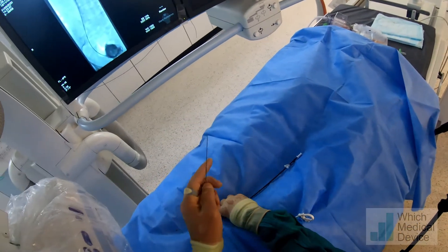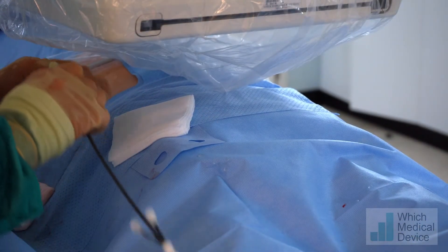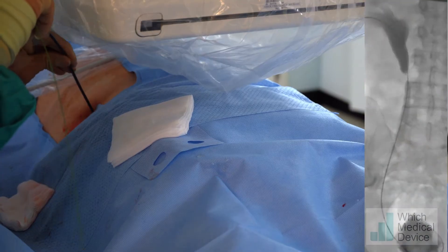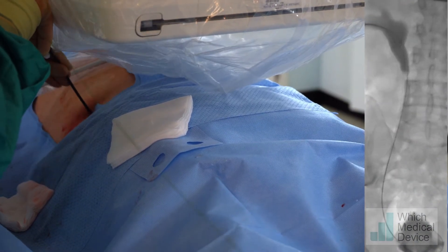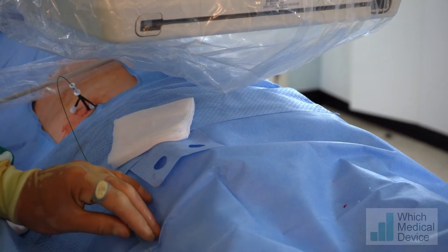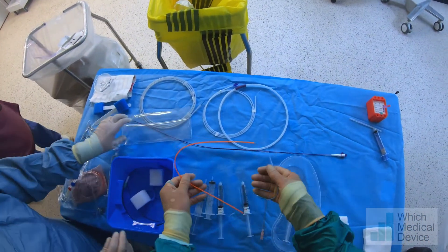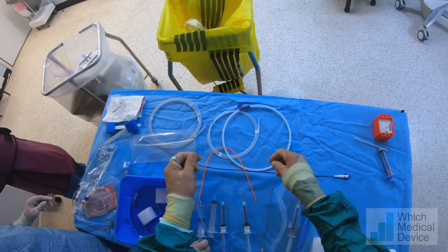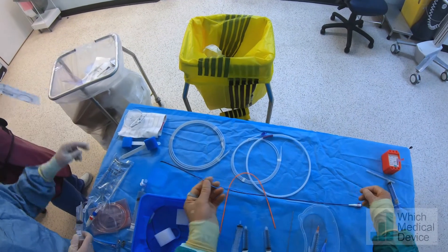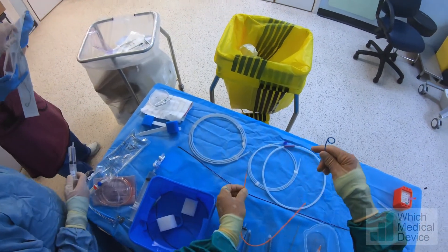I'm using a 9-French peel-away sheath — I could equally use a vascular sheath. The advantage of this is I can peel it away around any nephrostomy I leave in. This is a double-J, double pigtail stent. I'm going to leave the thread on the end, which will allow me to pull the stent back if I advance it too far. We've got a pusher here with a radiopaque marker on it, which we can see when we put it through the peel-away sheath.